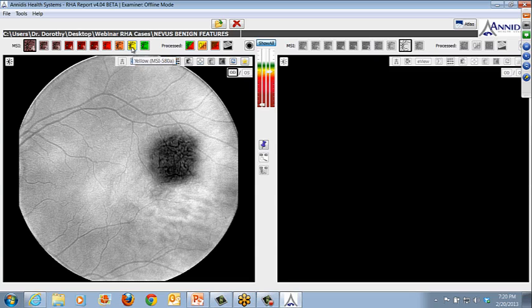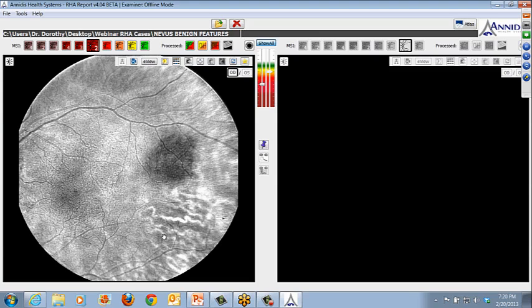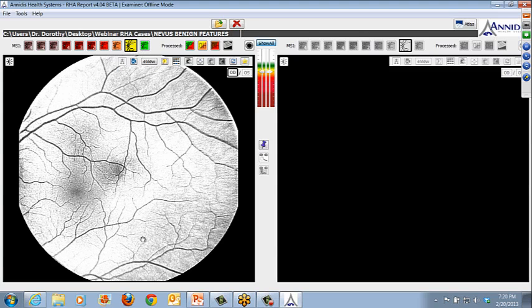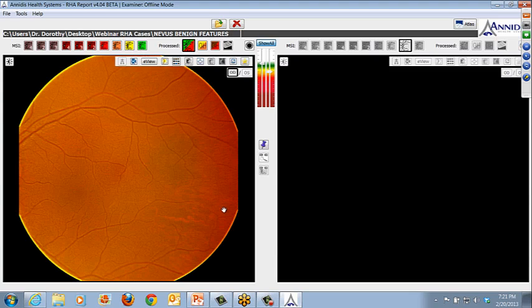Nice smooth borders. It's in a location that is sort of on the edge of the high-risk area, right? The most high-risk areas are juxtapapillary and posterior pole. If you look at the yellow and the green, these are a little hyperreflective here, but you want to look at this level to see if there's overlying drusen, and you want to do a clinical exam and at least reference your color image and look for overlying lipofuscin, right?